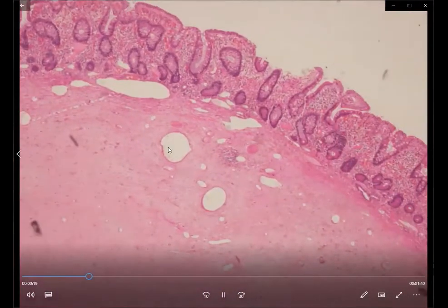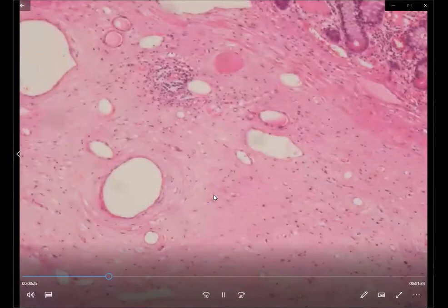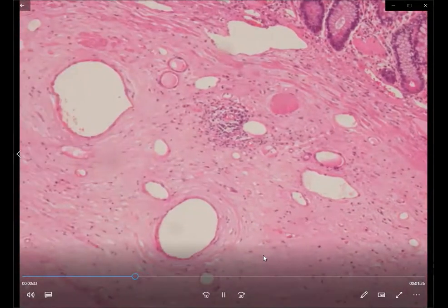In the entire expanded submucosal lesion, we could see that there are proliferated vessels, like these are all proliferated vessels that we are seeing here. And on going on high power into these vessels, we could see that these are thin stromal cells that are there within the submucosa.